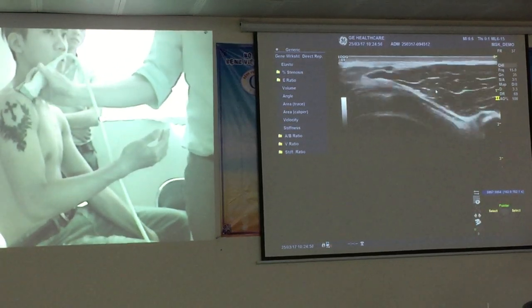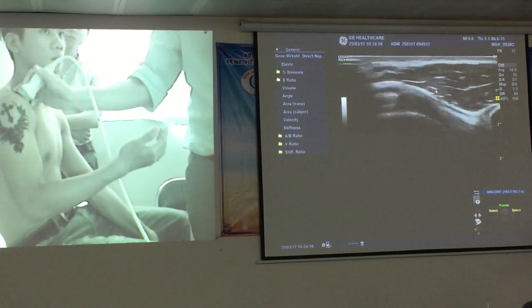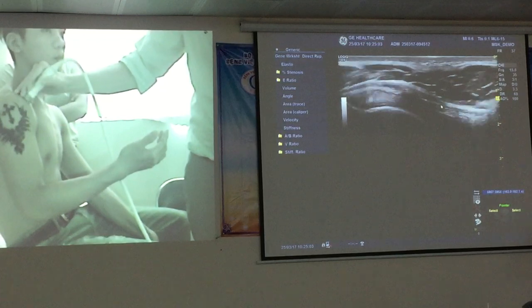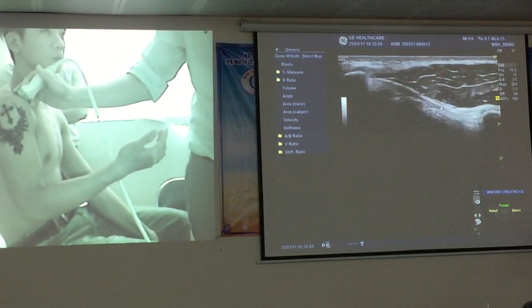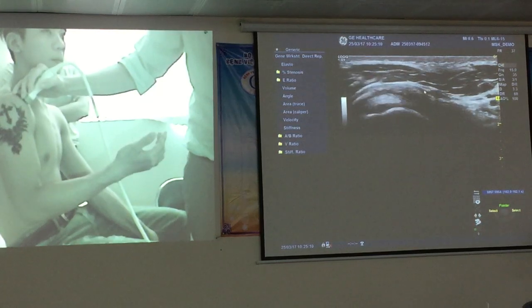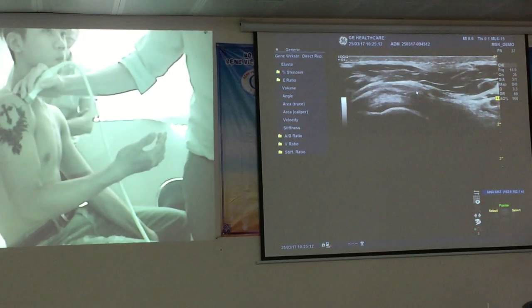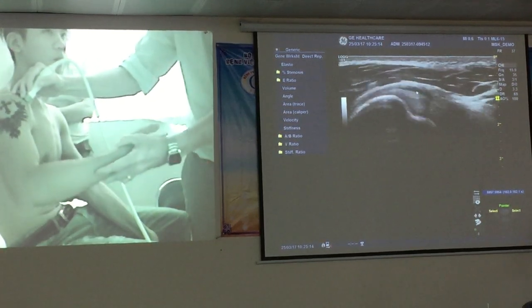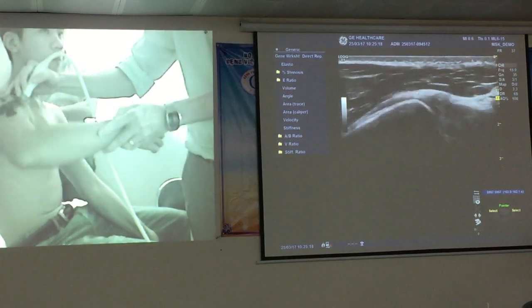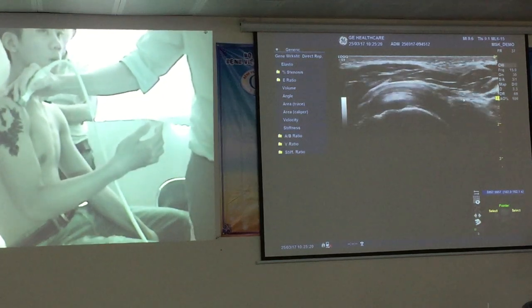Có một mẫu và hâm dày nhỏ ở ngay phía trên của bao bọc dịch, cái đó là nó điểm bám của cái dây chằng. So there's the CA ligament there in long. If I turn on that, there it is in short axis. So you can see this is the bursa. So it's just at that point. So this patient is getting a little bit of a rub of the bursa underneath that CA ligament.